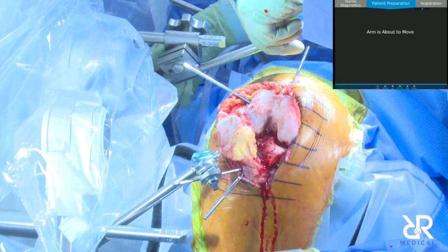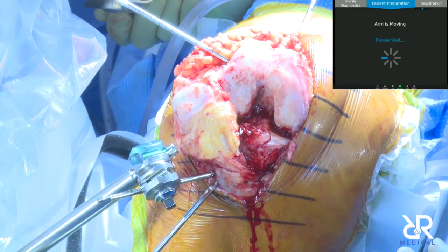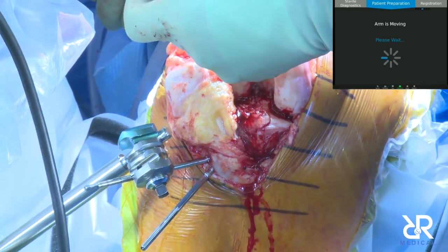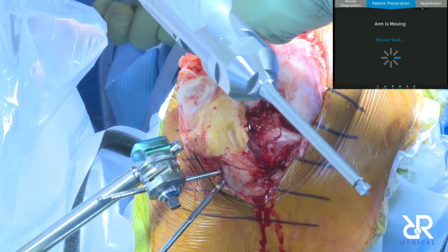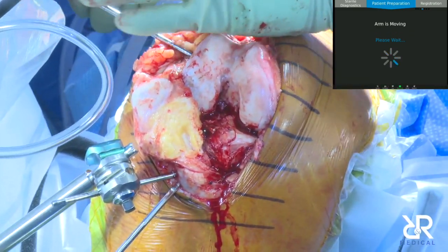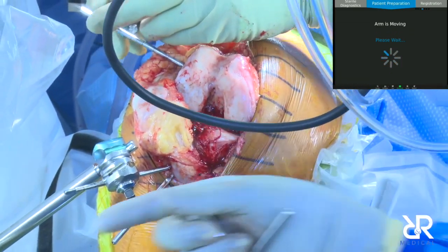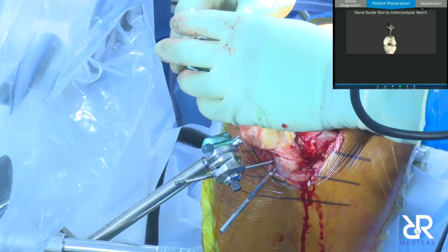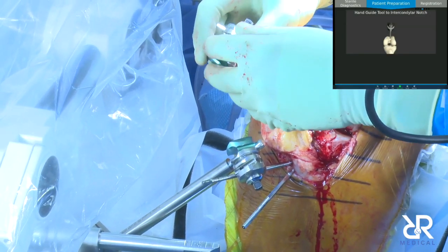So yeah, probably the biggest challenge is that posterior lateral corner. So the first couple, I would evert the patella and then see how close you get. And then sublux.